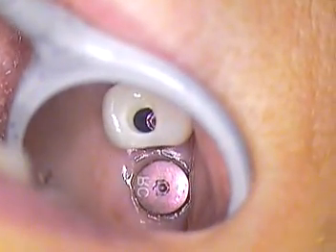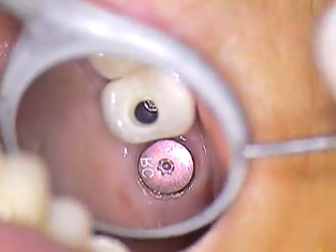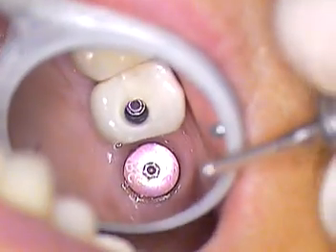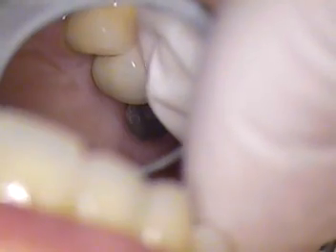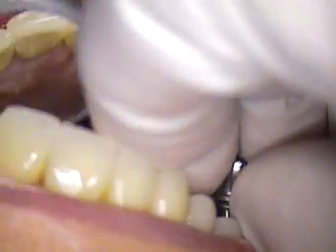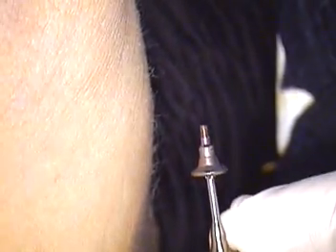My surgeon did a great job for what he had to do, and in a subsequent video we'll look at the pre-op photos, x-rays, etc. We'll give you, the viewers, a chance to see her case before we finished with it. So okay, we're going to unscrew the next component. Okay, we're ready to lift out. Open up a little bit wider. She does that. We'll get that out. This is identical to the other healing abutment.